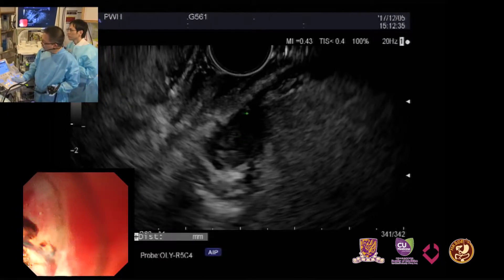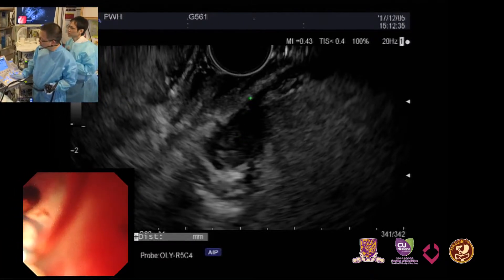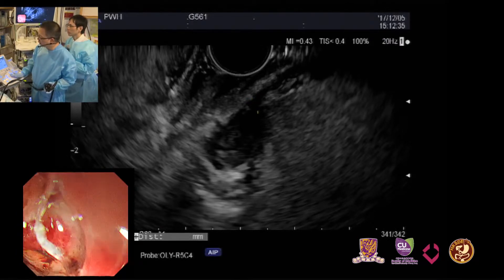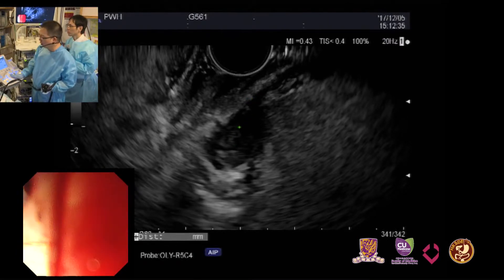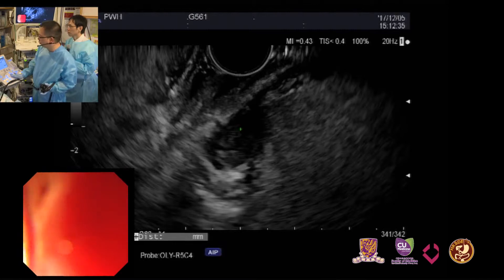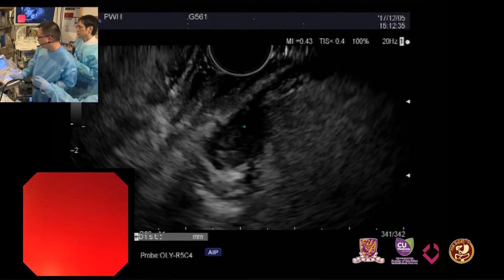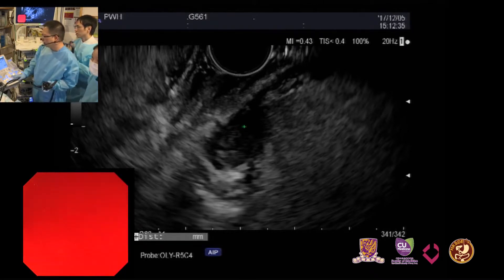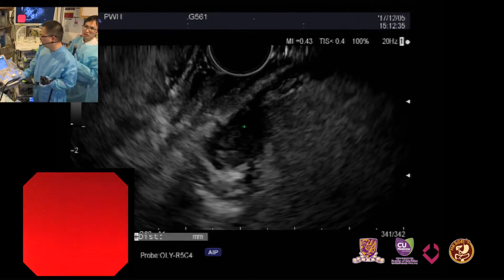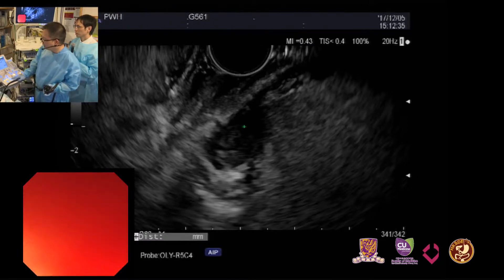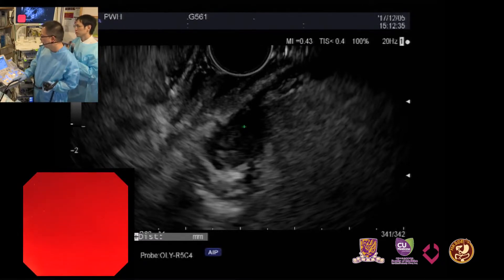We can see this is the submucosa layer and this is the fourth layer. This lesion originates from the fourth layer. In this layer, the submucosal tumour differential diagnosis includes GIST or leiomyoma.